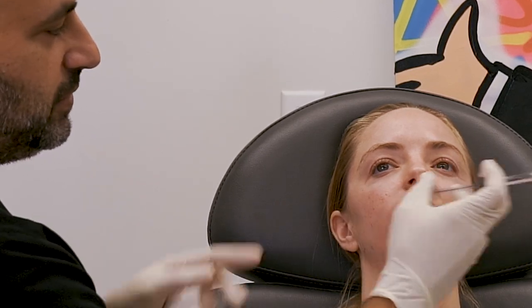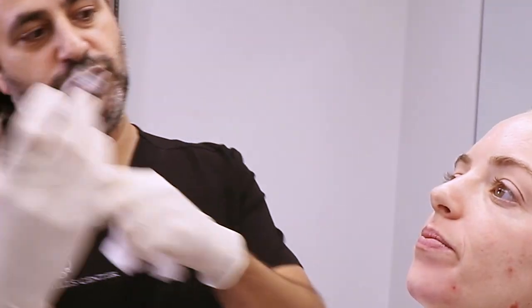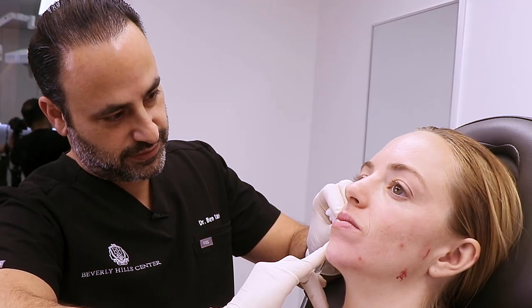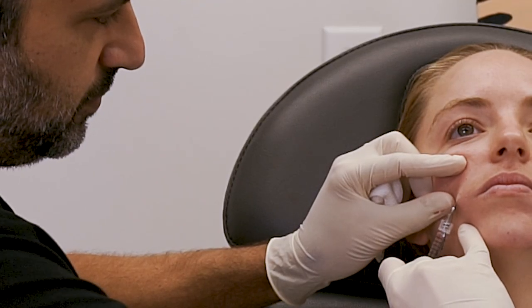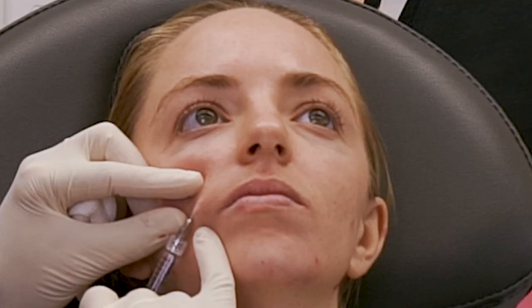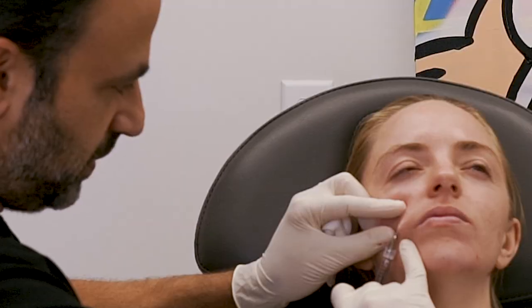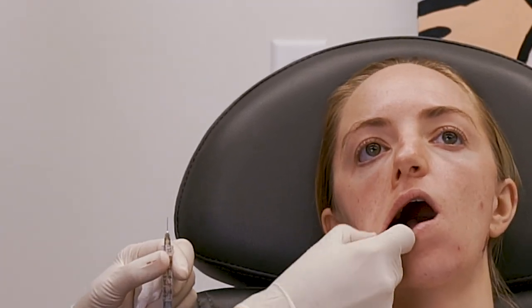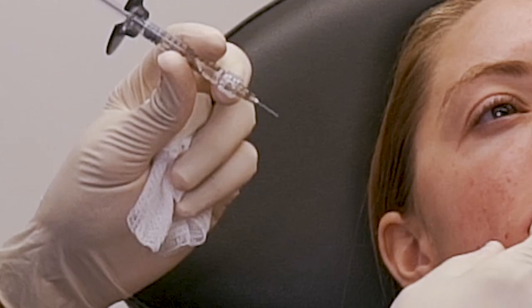This person is a strainer, so we have to go in superficially — intradermal or directly subdermal. I tent it out, go upwards, and this is going to be a retrograde injection. Retrograde injections are better for this area because you're letting your needle guide where the filler goes versus pressure guiding it. You do have to go back and smooth it out because you're going so superficially. If there's a little white dot, you can leave it — it's fine. Or you can touch it with your needle and squeeze out that superficial filler.